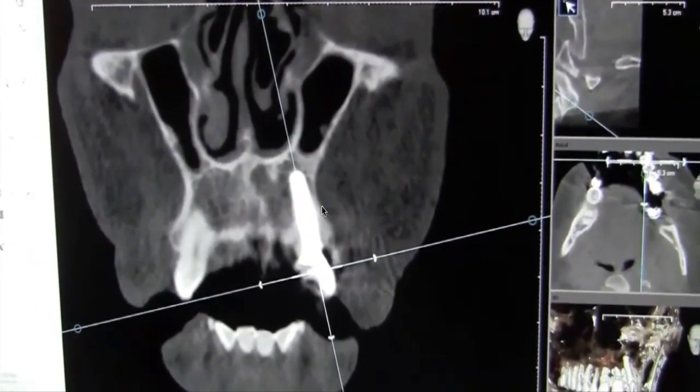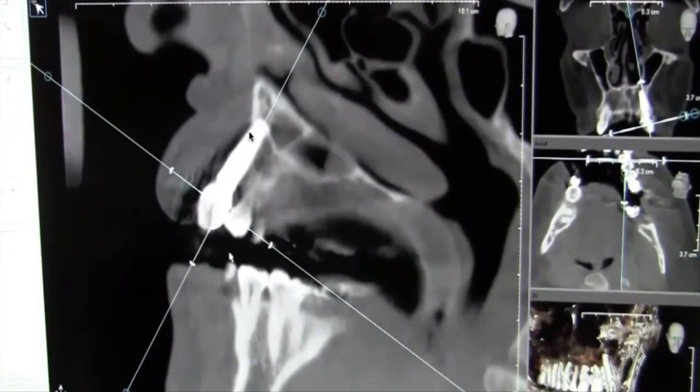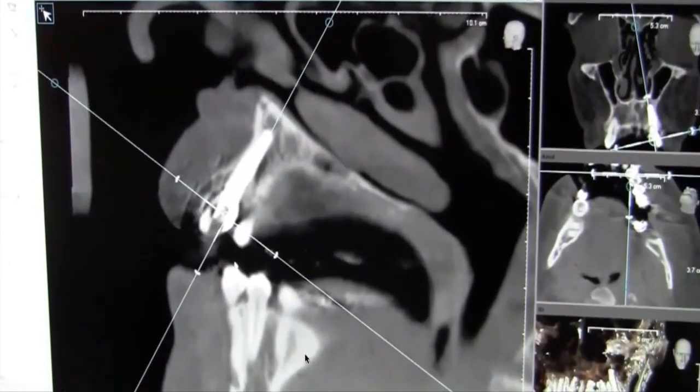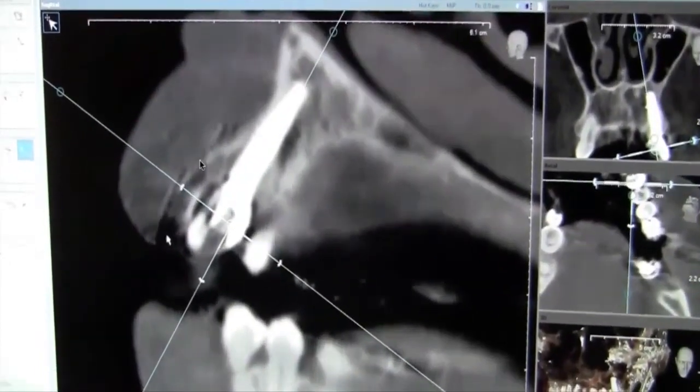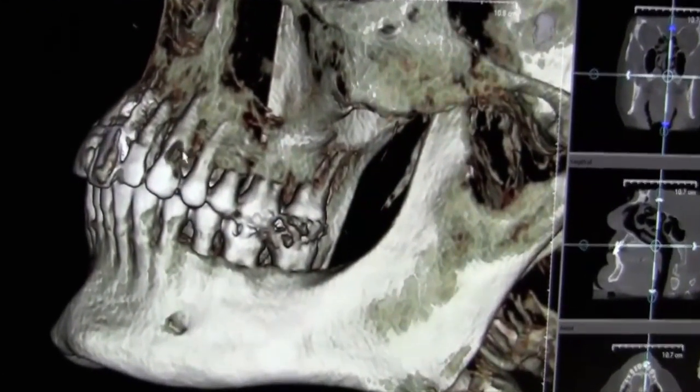You can see the facial table over here. We were able to maintain it, and this is a different view. And again, look at the tables being maintained. At the coronal level, we got an excellent facial table, which is going to be good for the long-term stability of the case and the perioprosthetic result that we are trying to achieve.